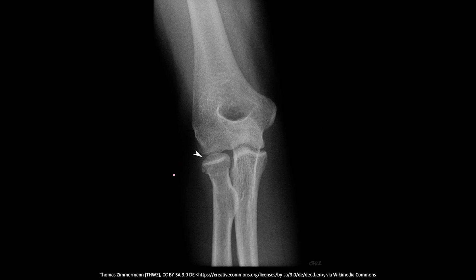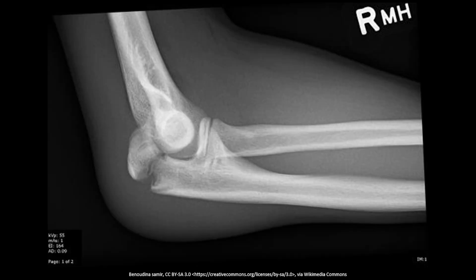In this AP elbow x-ray of a patient who fell on their arm, we can see a subtle radial head fracture annotated by the arrow. In the final example, we have an olecranon fracture with elevation of both the anterior and posterior elbow fat pads, indicating joint effusion from the intra-articular fracture.